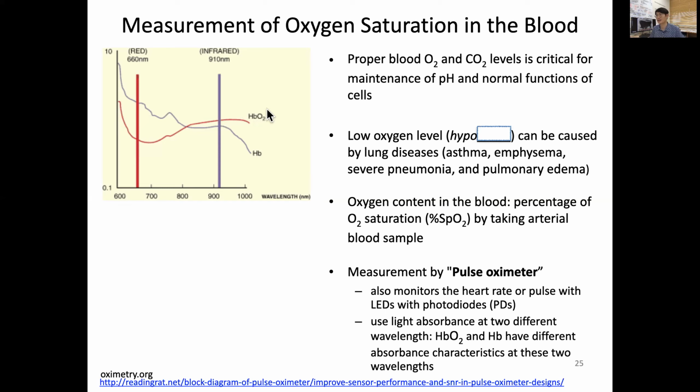So that's the oxyhemoglobin spectrum and deoxy. In principle, there are only two unknown concentrations. So you could just use two colors of light sent through the tissue and detect, and you can recover the concentration of two variables. So that's the trick.